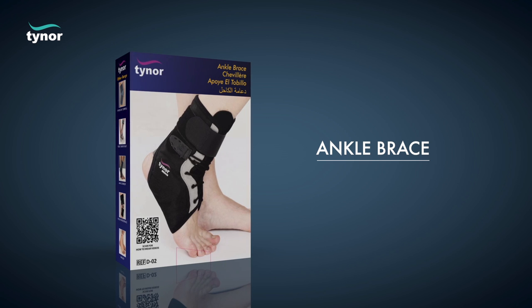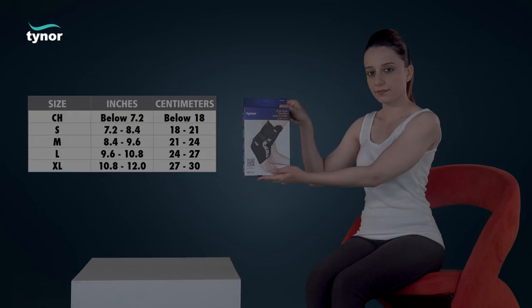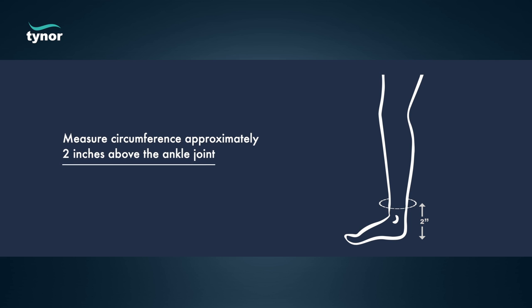Here we will discuss how to measure the size and how to wear the ankle brace. The ankle brace is available in these sizes. Measure the circumference approximately two inches above the ankle joint.